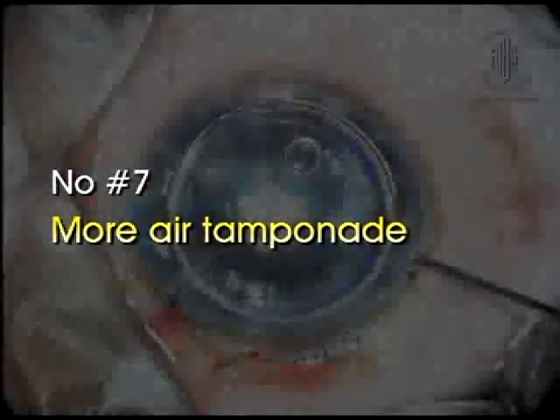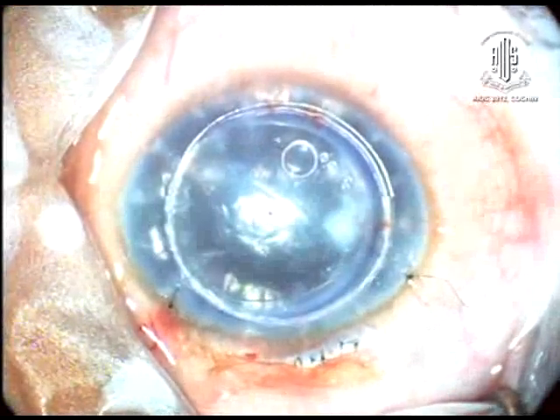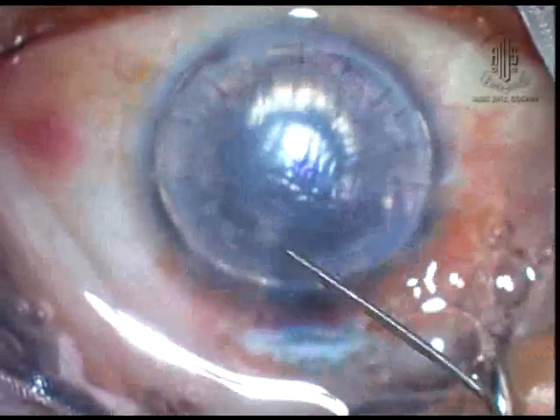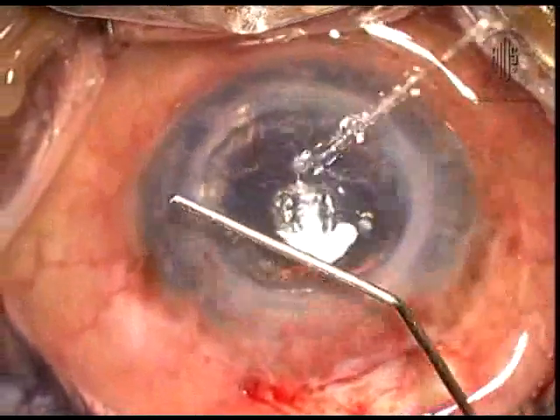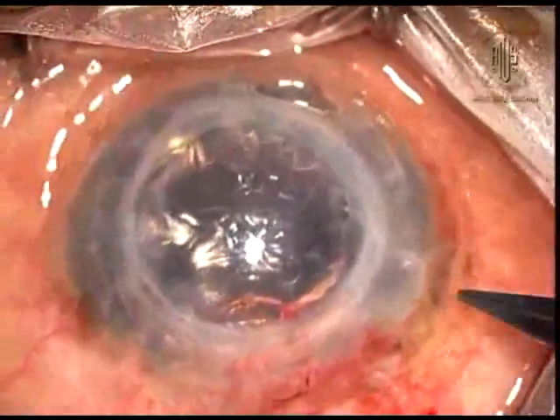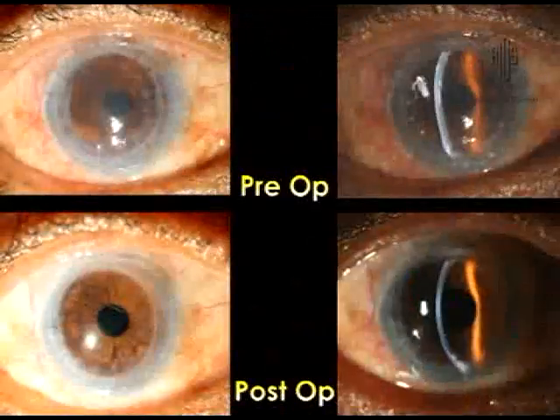Number 7. More air tamponade. It may be for 20 minutes rather than conventional 10 minutes. And only a little air is released at the end of surgery. And when the epithelium is removed, a bandage contact lens is given. These are some of the cases with good anatomical and surgical outcomes.